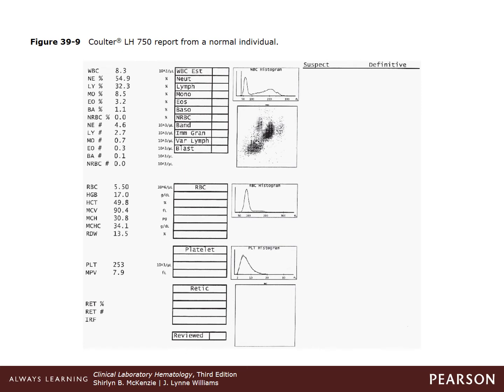The second portion here, you're used to seeing a total red blood cell count, as well as the hemoglobin and hematocrit portions to tell us if we have some kind of anemia happening. From these, we can classify the type of anemia from our red blood cell indices by calculating the MCV, MCH, and MCHC values.